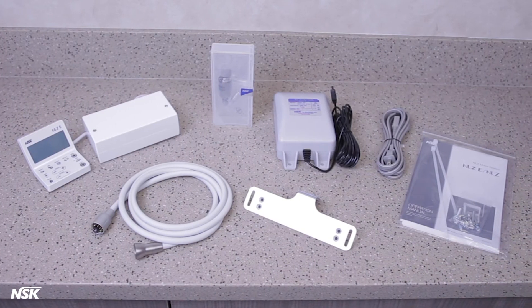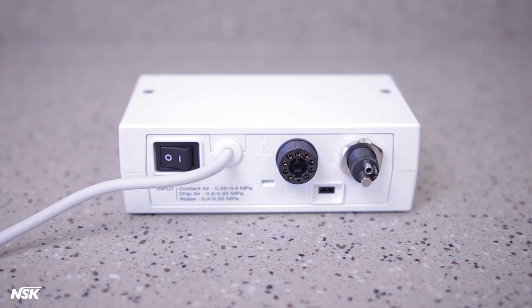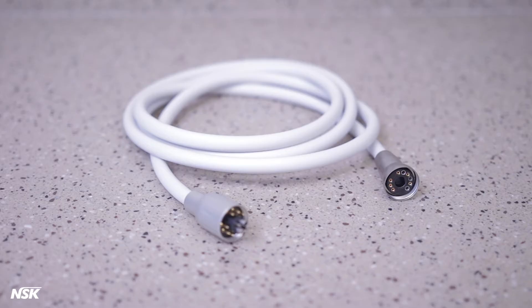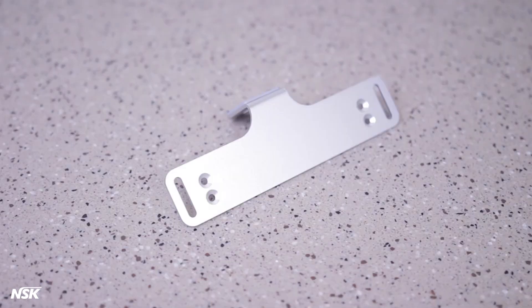Inside the box, you'll find the following: the control unit, also known as the touch panel; the main unit, also known as the module, which is connected to the touch panel via the link cable; motor; motor cord; AC adapter; AC power cord; and mounting bracket. This bracket is used to mount the module on the delivery unit.